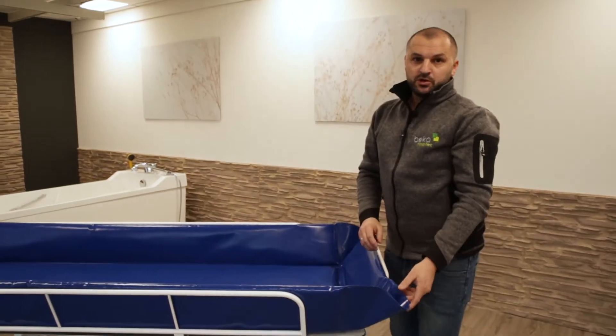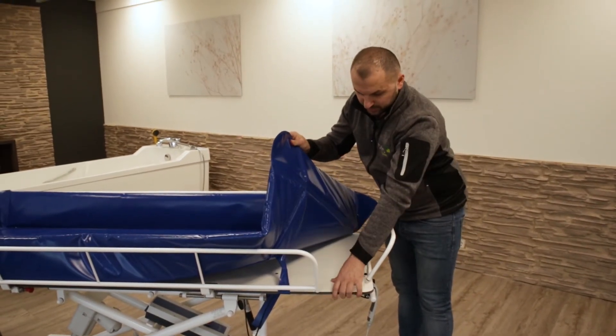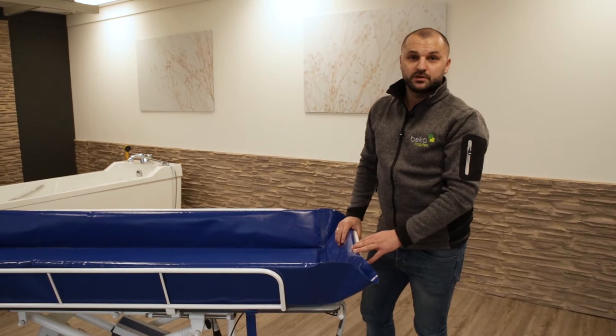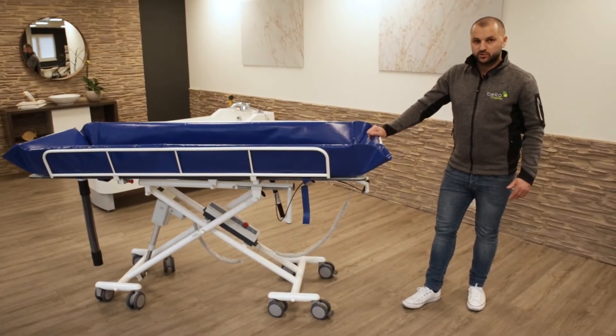At the same stage, check the table below the mattress. Make sure that the table doesn't have any cracks. Next, we will take a closer look at the chassis.